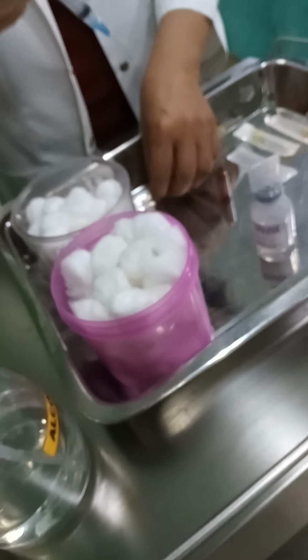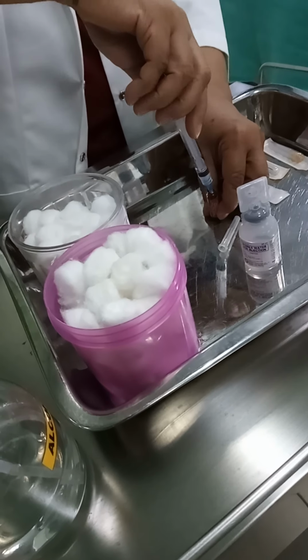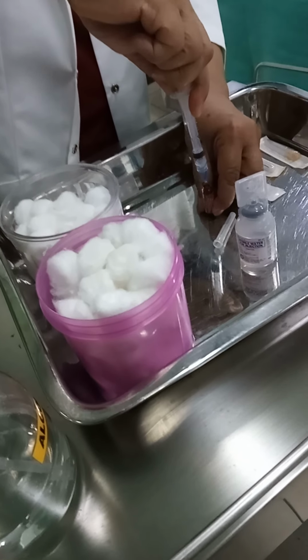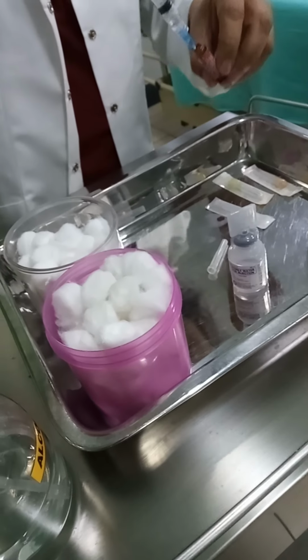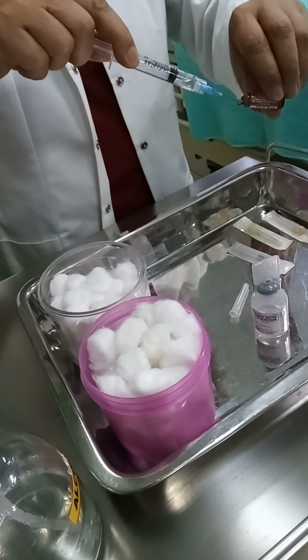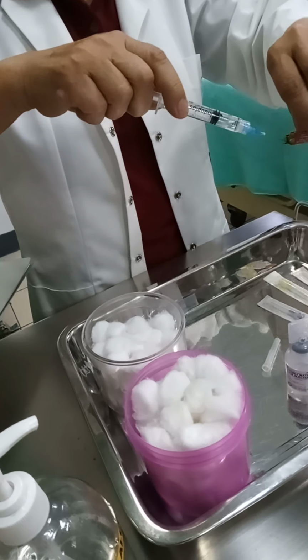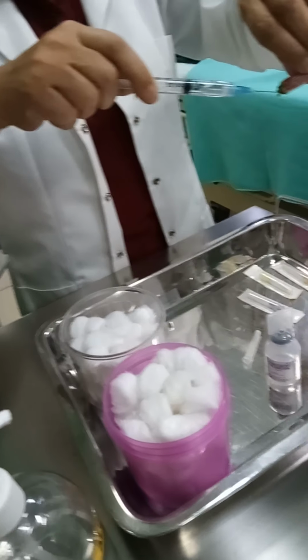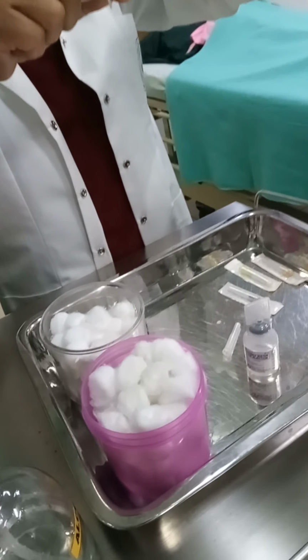Insert the needle into the center of the ampule opening. Do not allow the needle tip or shaft to touch the rim of the ampule. Draw the medicine quickly. Aspirate the medication into the syringe by gently pulling back on the plunger. Keep the needle tip below the surface of the liquid. Tip the ampule to bring all fluid within reach of the needle.